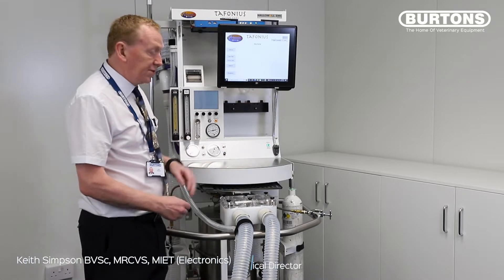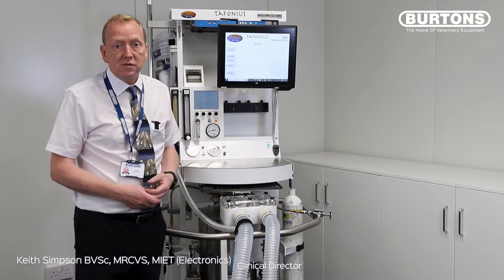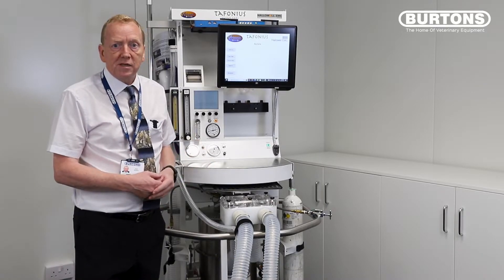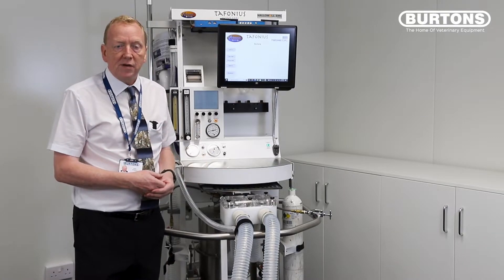Hello, my name is Keith Simpson and in this video I'm going to talk to you about the Tafonius setup. This is a very brief introductory video just to explain the initial leak test and compliance testing of the machine, the initial setup for ventilation, and then pushing the button to start ventilating.